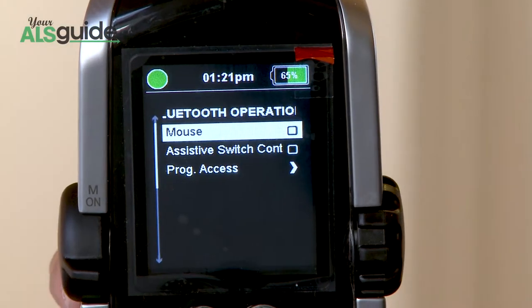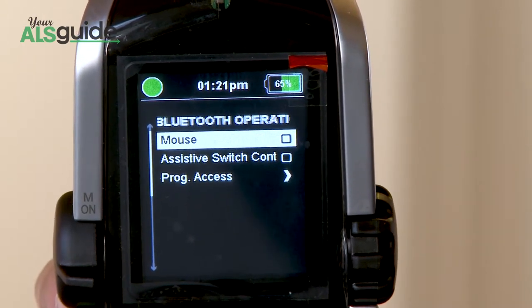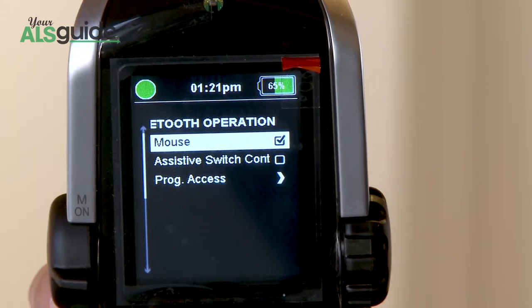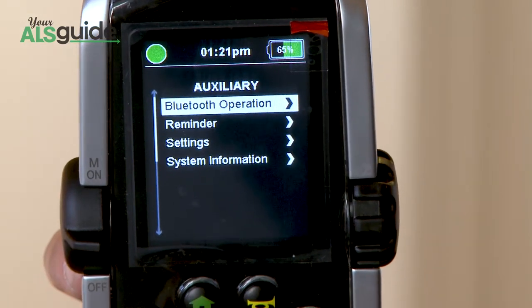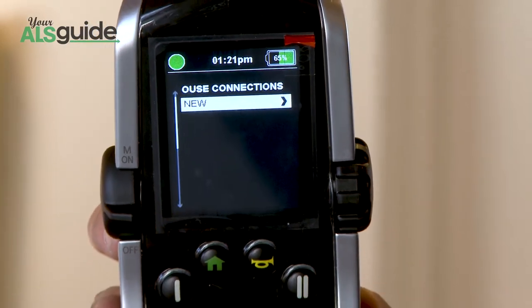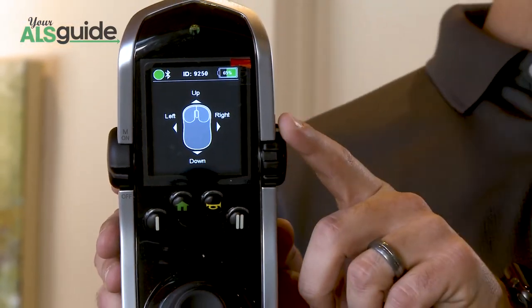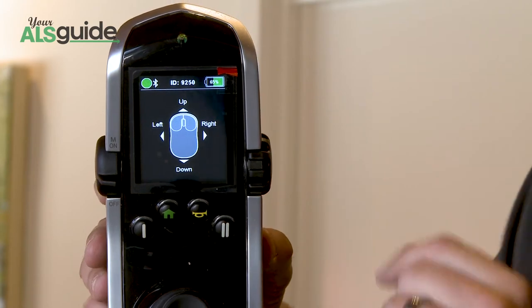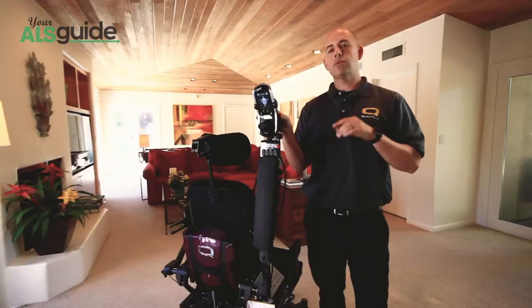So basically, it's a very simple process to pair your device. You're going to go into the mouse section. You're going to check that. And you're going to come out of here. And you're going to go into your Bluetooth operation. Mouse connections, new. And now the screen is going to pull up and you're going to see this mouse emulation mode. And you also have an ID at the top here. And that's what you'll use to pair.